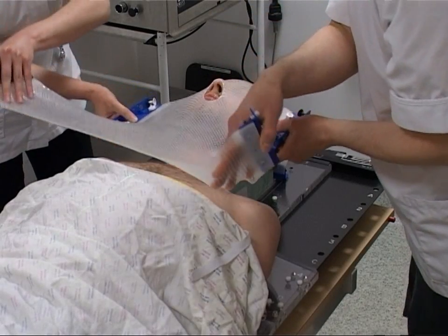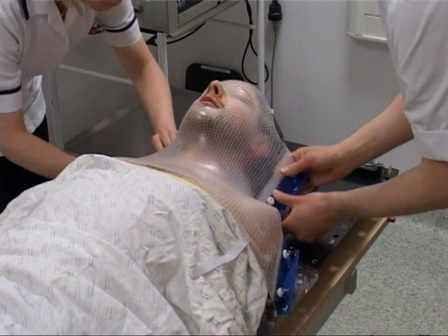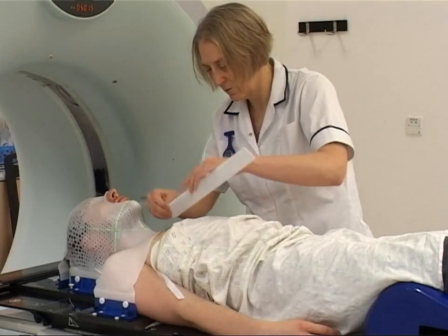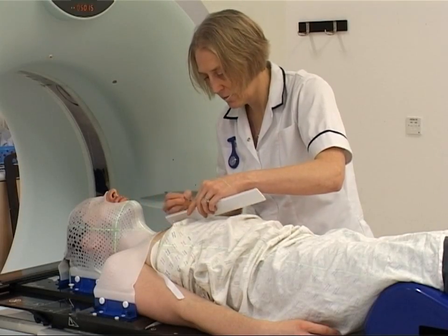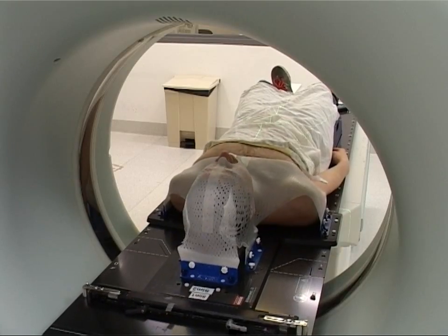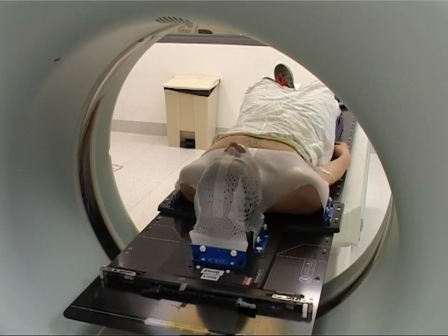If you are having radiotherapy to your head or neck, you may need to have a radiotherapy mask made. The mask makes sure you are able to stay perfectly still for treatment and also avoids you having to have marks drawn on your face or neck.